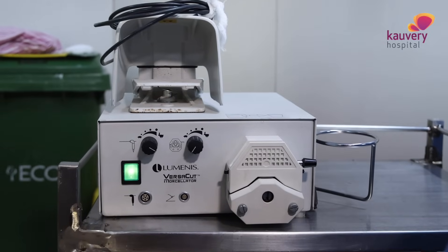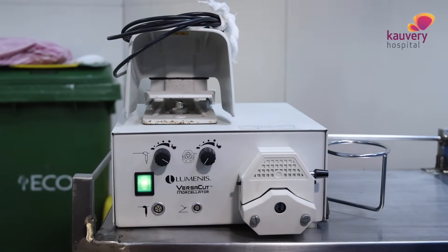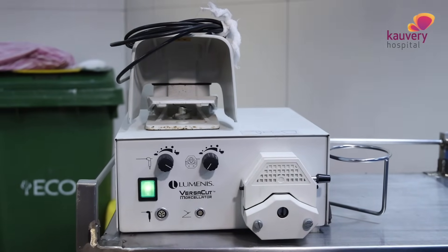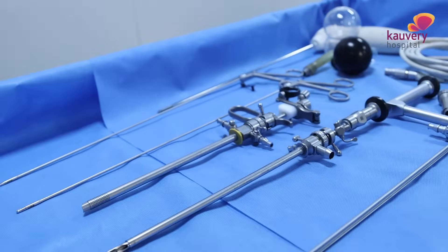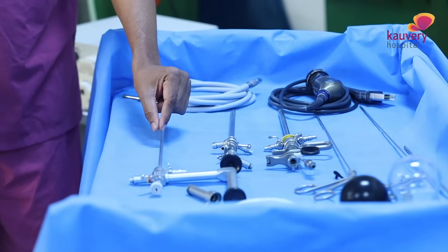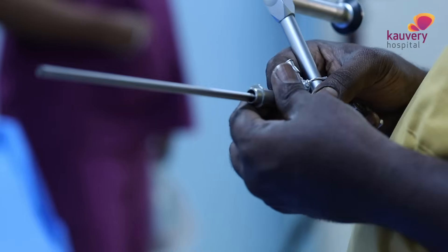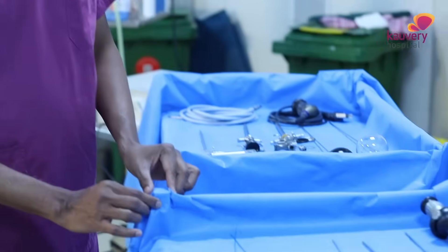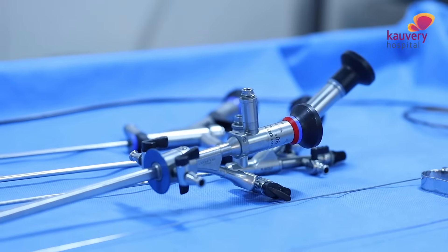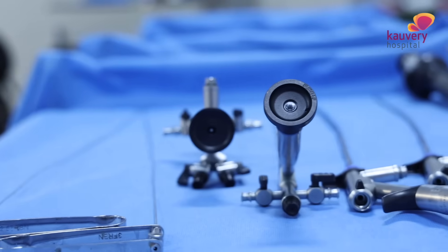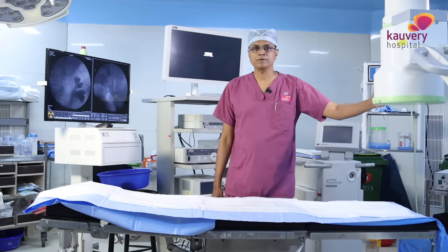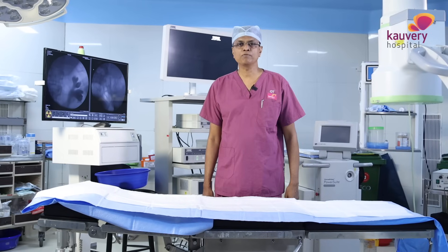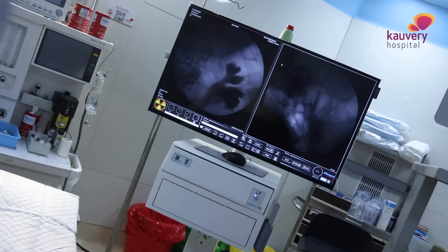We are using an important instrument called the Morcellator. This is the most important equipment for the procedure — it morcellates the enucleated tissue. This instrument is called the Morcelloscope. For urinary stone disease and kidney stone management, we also use C-Arm fluoroscopy, which allows us to see what we are doing in real time during stone procedures.